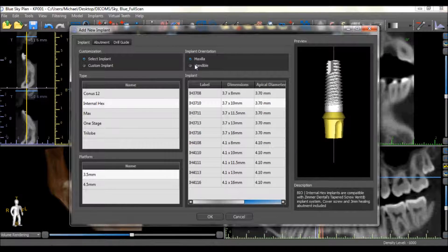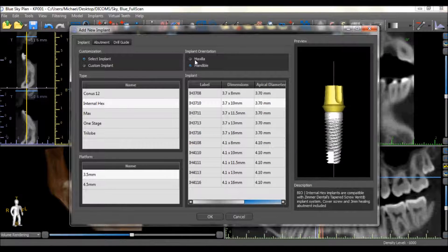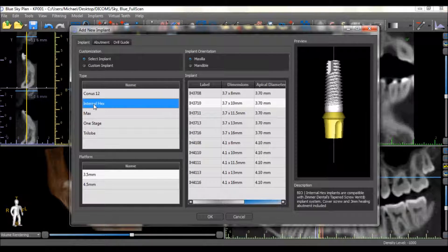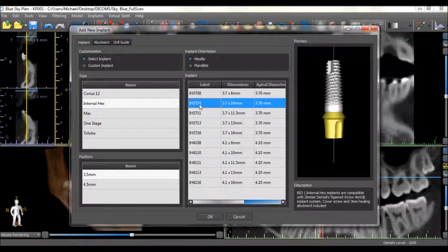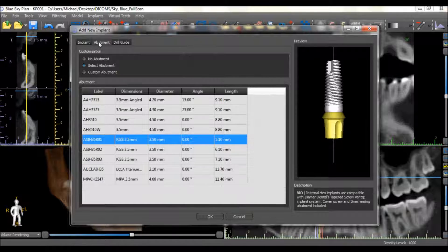Select the relevant jaw type, the desired implant system, and the relevant implants. An abutment can be added by selecting the abutment tab. The software will display the abutments compatible with the implant that was selected.